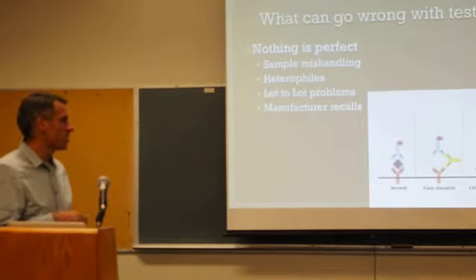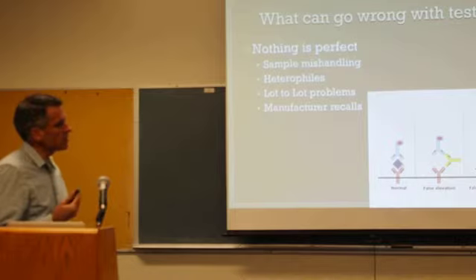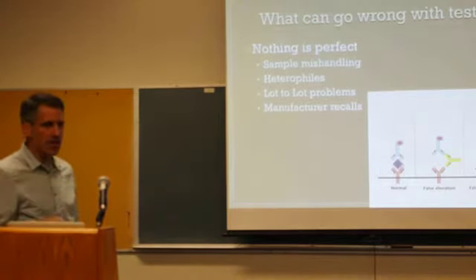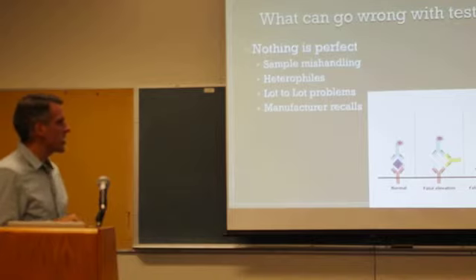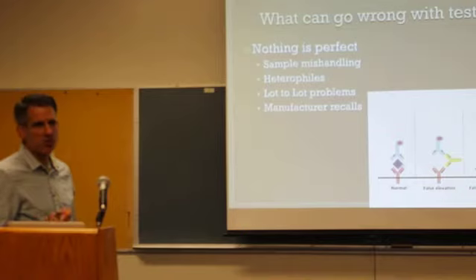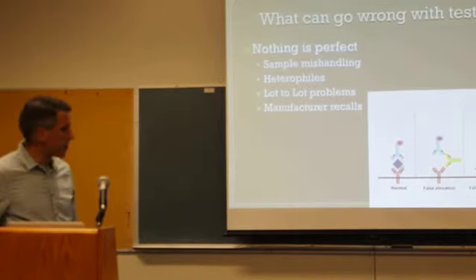And so you create what I call an artificial sandwich, or an incorrect sandwich. And that happens, with all the testing we do, we catch one of those, say, once every 2 months, not on these assays, but just in general on all the different assays we do. So you've got to keep your eye out for when the results don't match the clinical picture. Nothing from the lab is perfect, and when you get a lab test that doesn't match what's going on clinically, you should always doubt the lab test, because nothing is perfect.